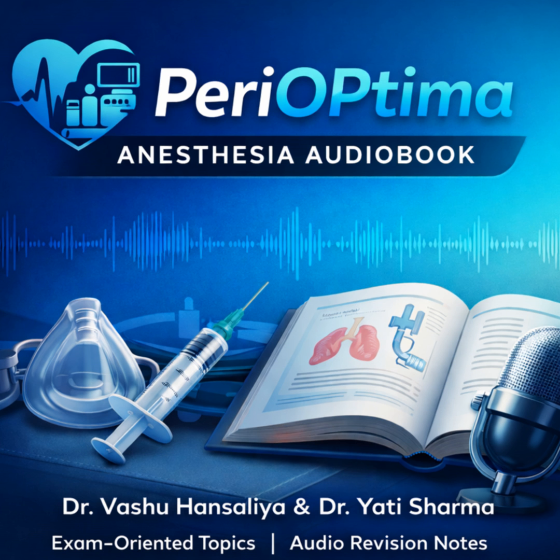Second, the HME schematic. Just a simple drawing showing it in the circuit between the Y-piece and the patient. You show how it captures and returns heat and moisture to fight hypothermia. And third, the hypoxia prevention system. A conceptual schematic. A diagram showing the linkage between the O2 and N2O flows. Use arrows to show how a drop in O2 pressure forces a reduction in N2O flow, guaranteeing that minimum FiO2.